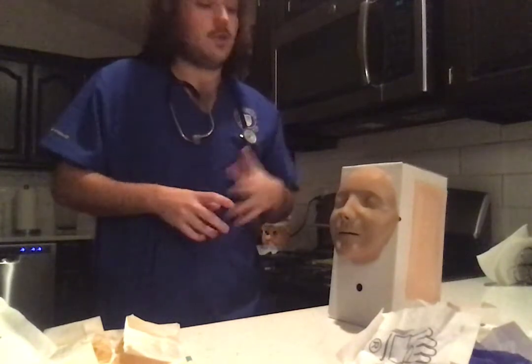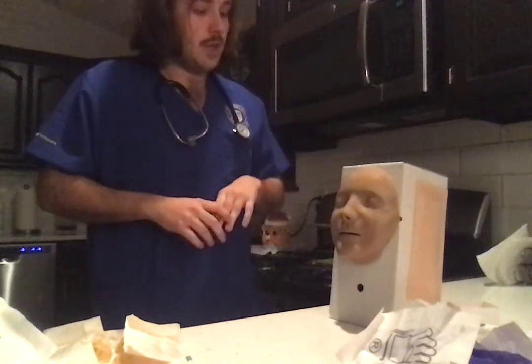Today we'll be going over trach suctioning and trach care. As you enter the patient's room, you want to verify the doctor's orders, that yes, he did order us to do trach suctioning, Mr. Laerdal, so that'll only take me about 15 to 20 minutes maximum.